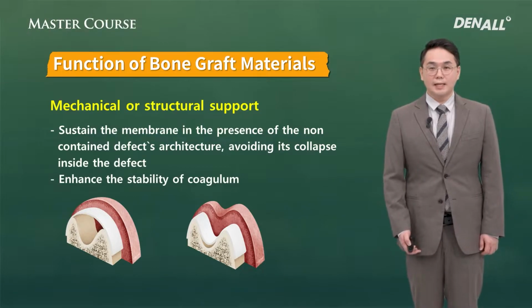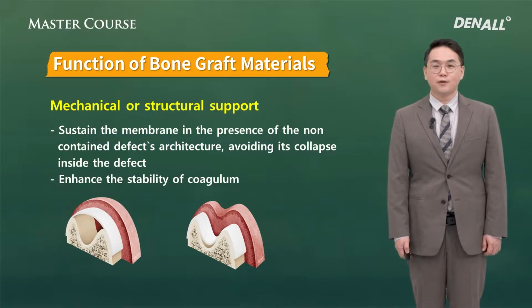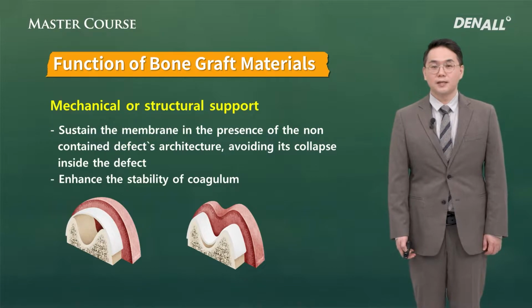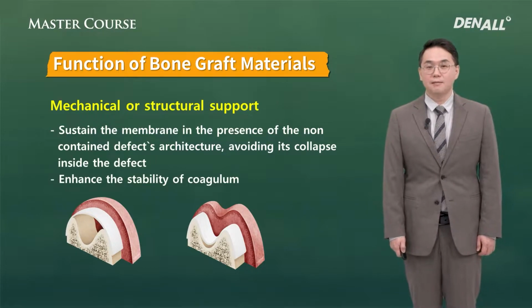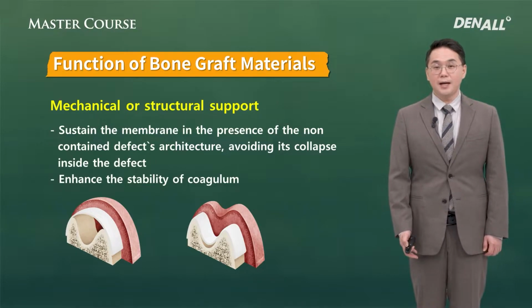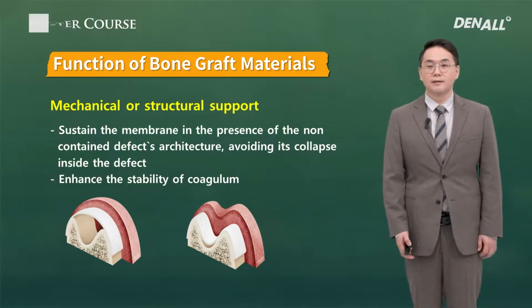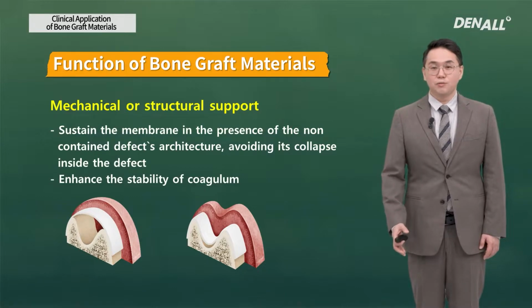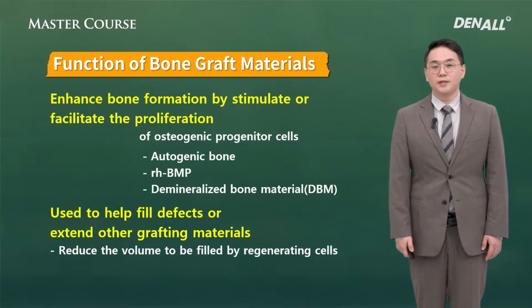Dentists believe that bone graft material itself is turning into the patient's bone, but that can be expected only when autogenous bone is used. Clinically, allograft, xenograft, or alloplasts are used more than autogenous bone. So when we do bone graft GBR, the role of bone graft material is providing mechanical support to the membrane, maintaining ideal alveolar bone contour around the implant. That's all they're used for.